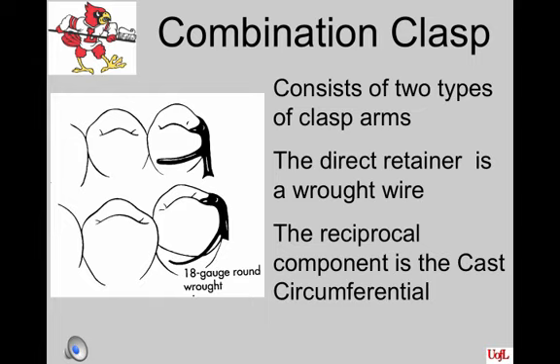If there is not enough room to dip down on the lingual and avoid the marginal gingiva by 3 millimeters and still have a lingual bar in that area that is at least 5 millimeters in width, then the lingual plate is used for reciprocation.